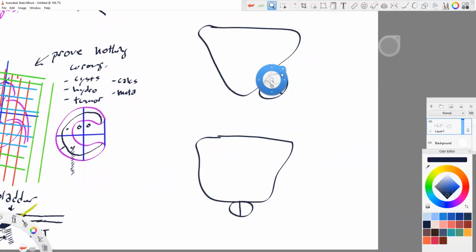Not necessarily a part of the exam. That is not a cracked egg. That is a prostate. Get to know what a prostate looks like as far as size goes, and you can go ahead and measure them until you get a feel for how big they should be.